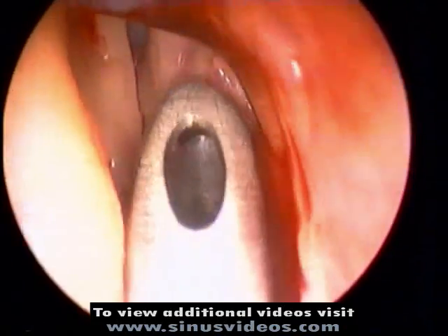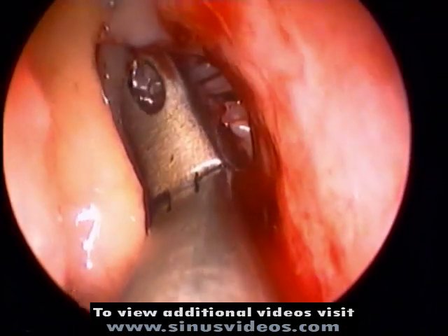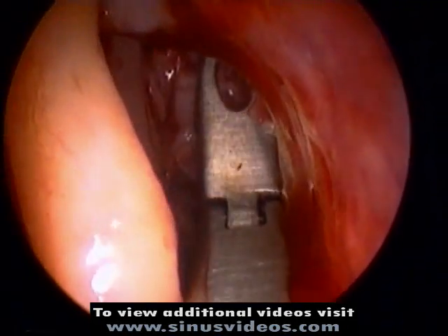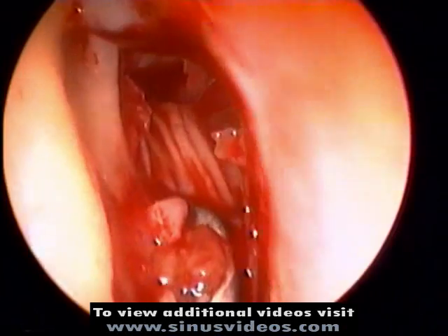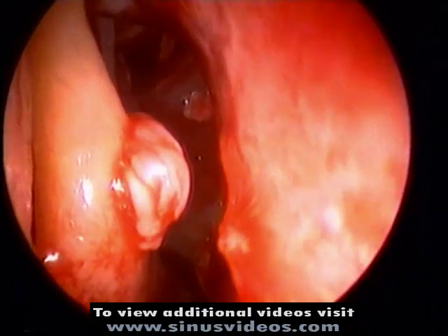This patient underwent sphenoethmoidectomy as an initial step to left endoscopic orbital decompression surgery for Graves' orbitopathy. The ethmoid bulla, mucosa, as well as any septa of anterior ethmoid cells, are grasped with an upbiting Blakesley forceps and removed.